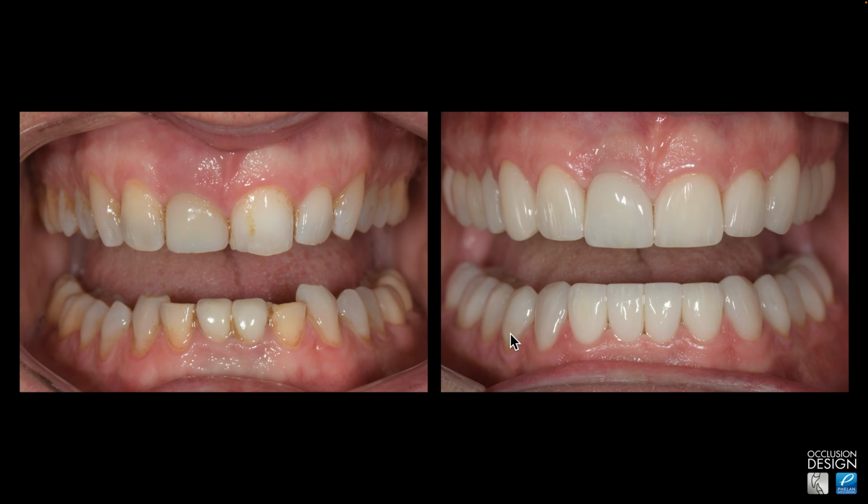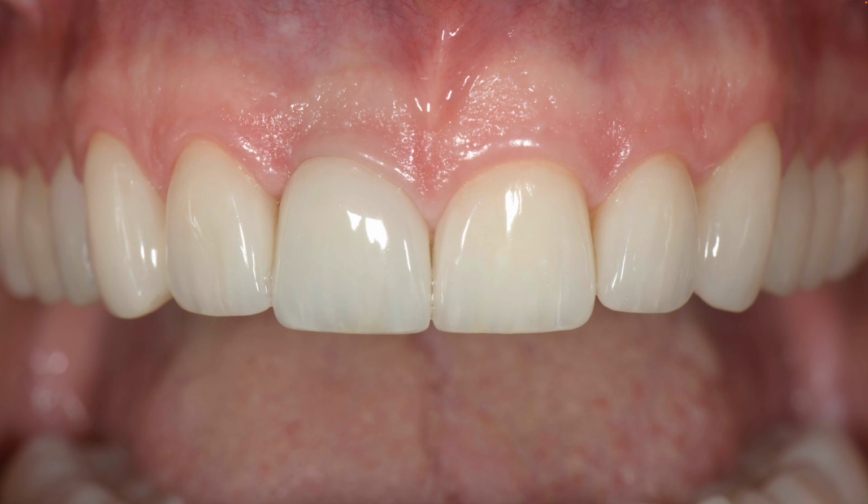These implants on the Nobel 1 were metal posts, metal abutments. So that's why we went with metal ceramic to block it out. The uppers is zirconia abutment. And then the rest are tooth supported, some of them veneers, some of them crowns. So big mixture of materials, but we were able to make this work.